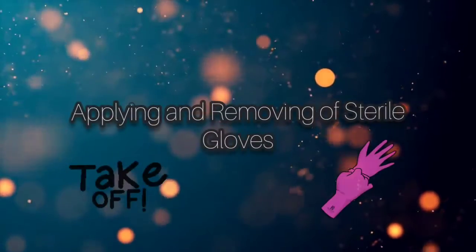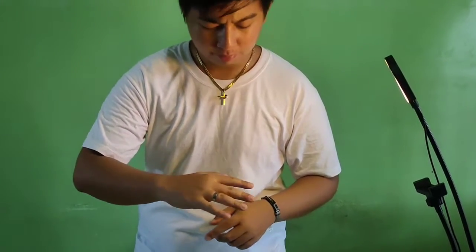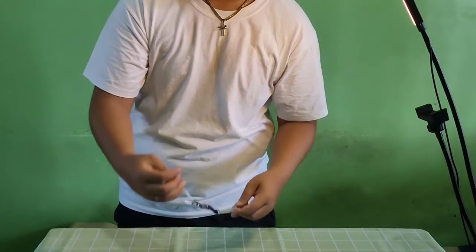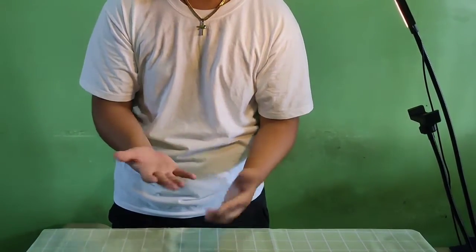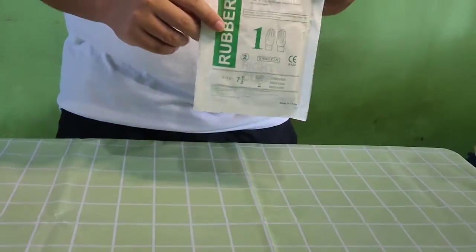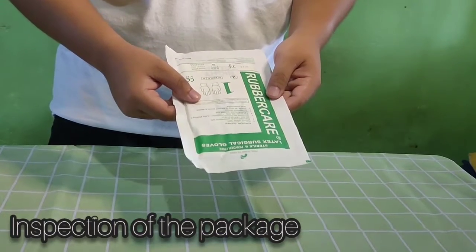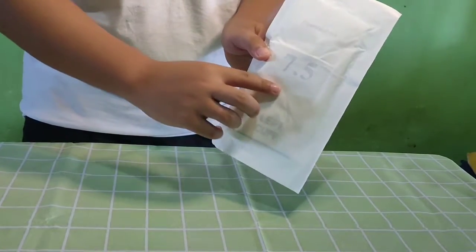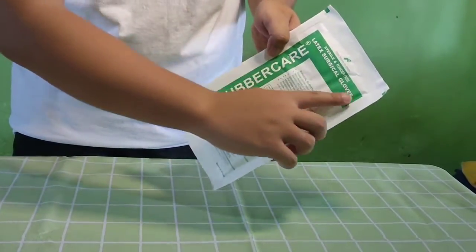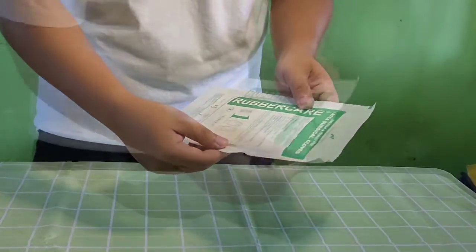After you do the hand washing, it's time for us to demonstrate how to put on and take off the sterile gloves. First, before you even begin to touch the package, make sure your hands are properly washed and sanitized, and remove all the jewelry like the ring and bracelet. Now, time to pick up the package. Examine the directions and the size, making sure it's your hand size, and the whole package. If there's a tear or a hole in it, better to discard it.